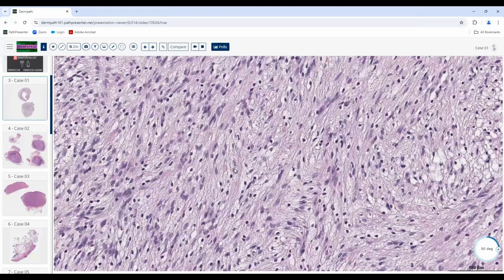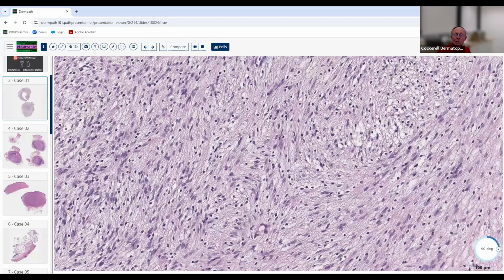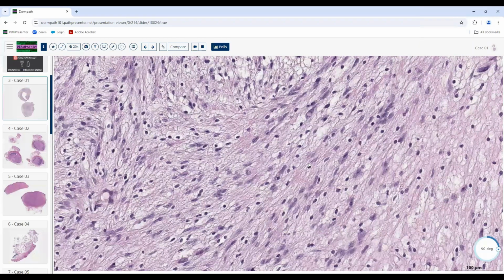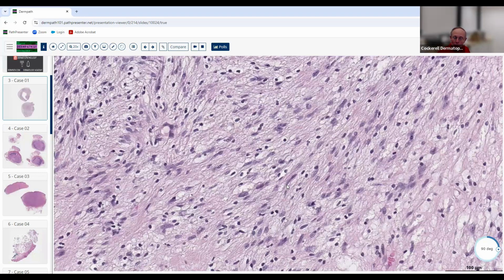I think more neural. Yes, it is more neural. Why did you say neural and not one of the other two? I guess it looks more like nerve cells, the spindle cells. They're more comma shaped. Okay, but you've got to know why they look like nerve cells. What's the morphology of a cell with nerve characteristics? Generally they have delicate, S-shaped nuclei, like you see here.